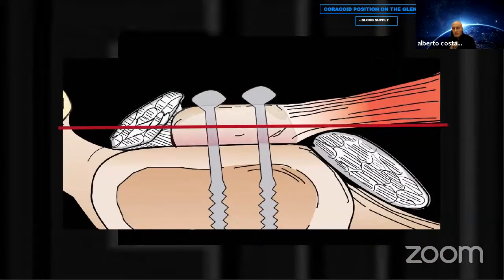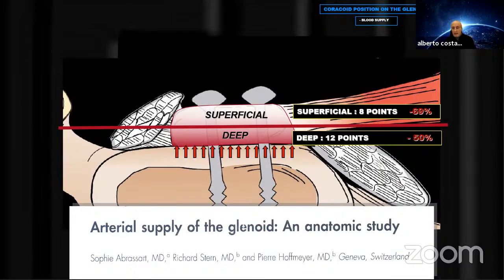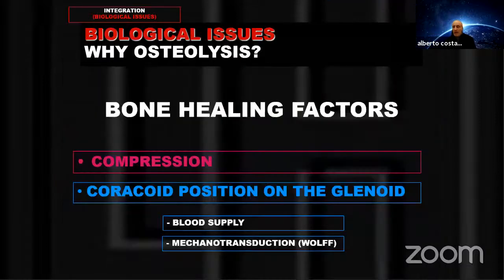So it's important that we have the deep layer, which is important for the blood that comes from the bone, and the superficial layer for the blood that comes from the conjoint tendon.